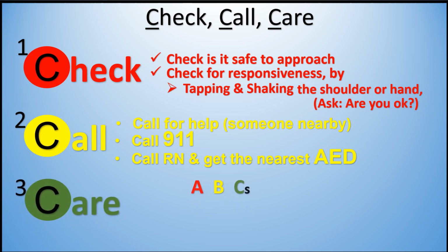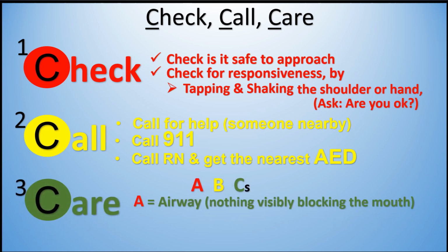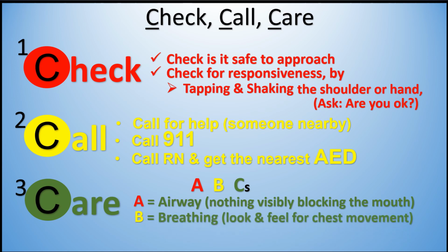Care. ABCs. A, Airway: nothing visibly blocking the mouth. B, Breathing: look and feel for chest movement. C, Circulation: check for a pulse.